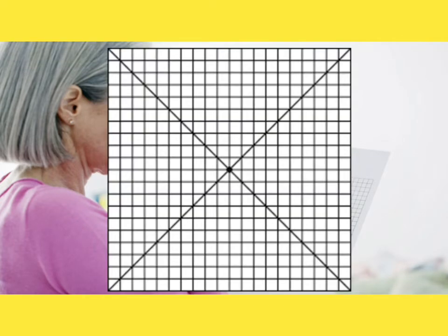Now let's move to another chart that you can see here. So suppose your patient is unable to fix on the central spot. Okay, so at that time this Amsler grid card is used, where two diagonal lines are drawn. These two lines will help the patient to fixate on the central spot. If the patient informs you that he cannot see the central spot, then you need to give this Amsler grid card so that the patient will follow these lines to reach the central spot. Okay, but the working is the same as this one.